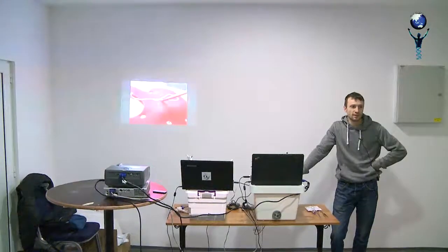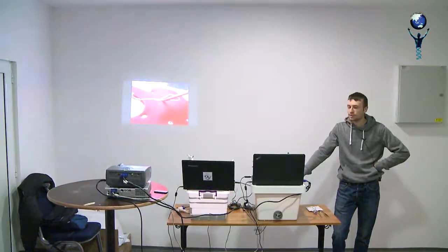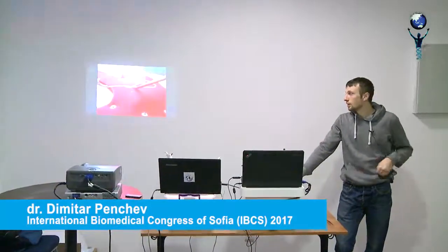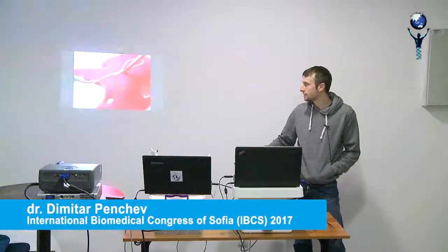Laparoscopic, some basics, orientation, hands, eye. You try to make some knots, some stitches by laparoscopic approach, to train your coordination. It's basics.